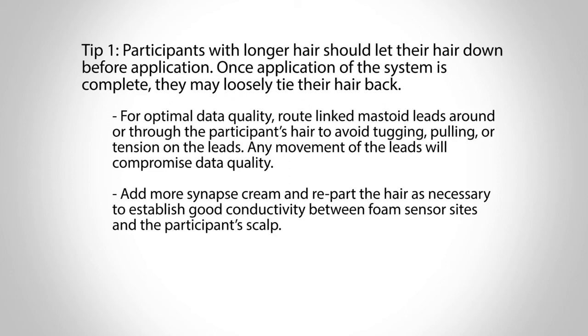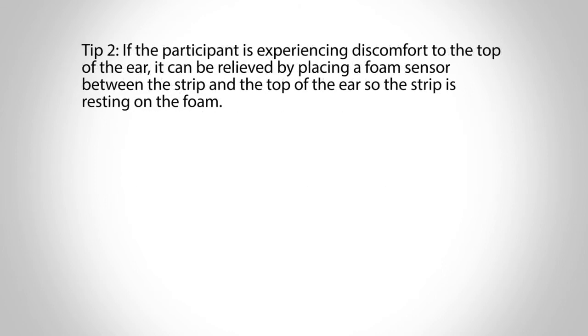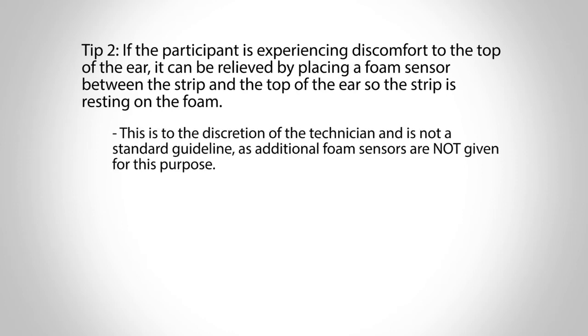Add more Synapse Cream and re-part the hair as necessary to establish good conductivity between the foam sensor sites and the participant's scalp. Tip 2: If the participant is experiencing discomfort to the top of the ear, it can be relieved by placing a foam sensor between the strip and the top of the ear so the strip is resting on the foam. Please note, this is to the discretion of the technician and is not a standard guideline, as additional foam sensors are not given for this purpose.